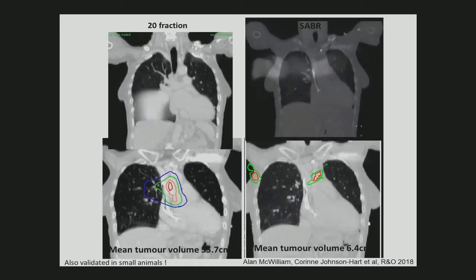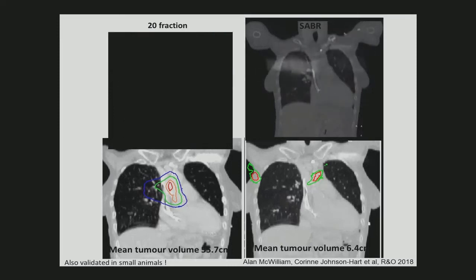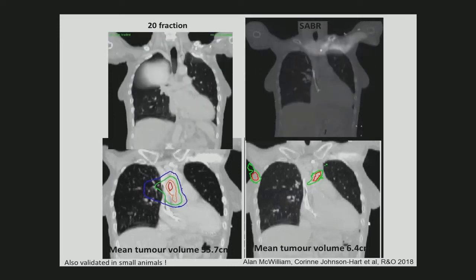Okay, so these are pictures of typical dose distributions that we were data mining, and this is the significant region. This was validated in an independent cohort of patients that were treated differently. So these are patients with small lung tumors, so you see the dose is quite a bit smaller, and you find the same region, although you find an echo region somewhere else.